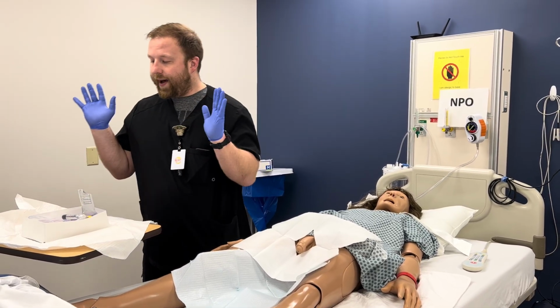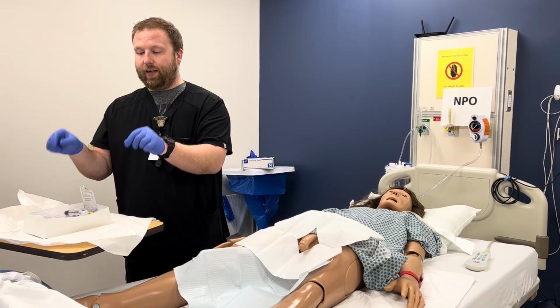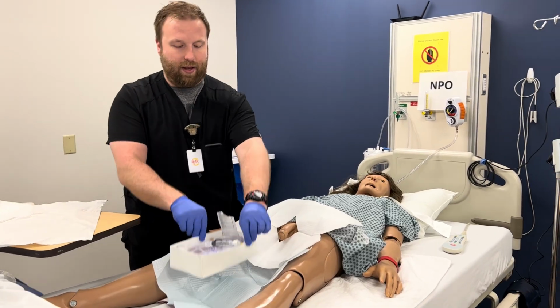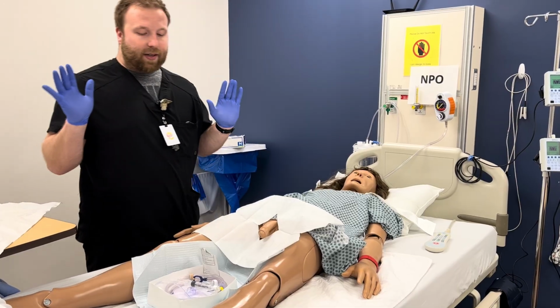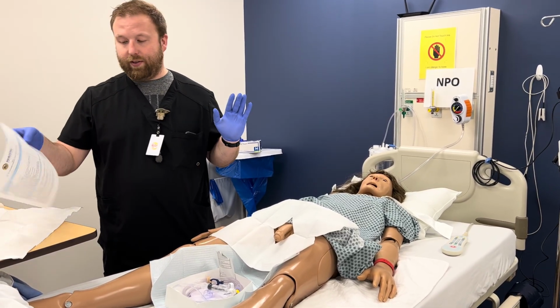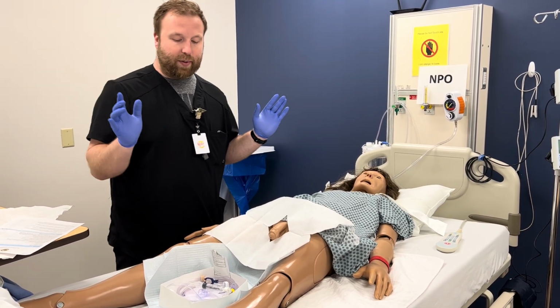Now, I have got everything that I need inside my kit. There's nothing else I need. With my sterile gloves, I will pick this up and I'm going to lay this down in the middle here. Because I have nothing else I can do with my sterile gloves, I will start cleaning my patient.